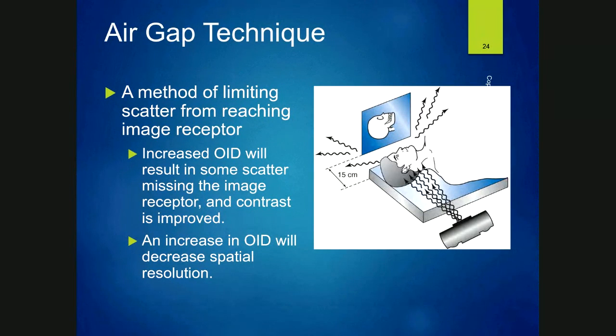That's scatter radiation. You collimated your beam to, say, a 7-inch wide area, but on the image receptor, you've got 12 or more inches of stuff that's actually showing anatomy. It's because of the work of scatter, and digital imaging is more sensitive to the effects of scatter.